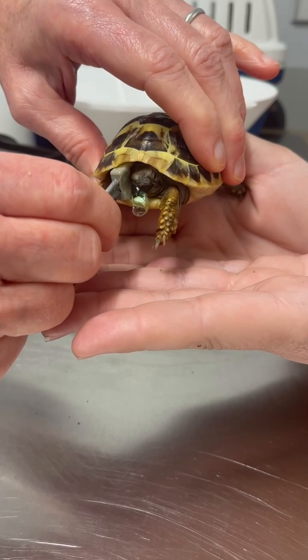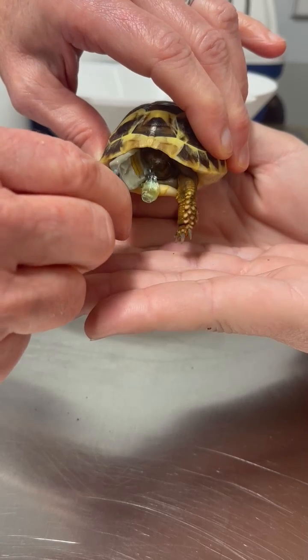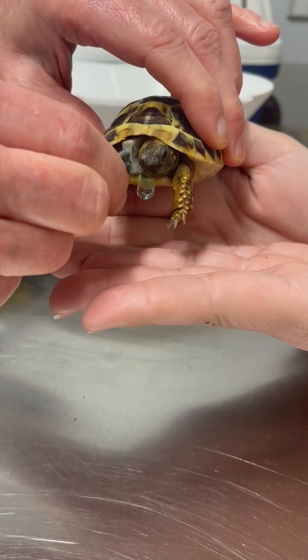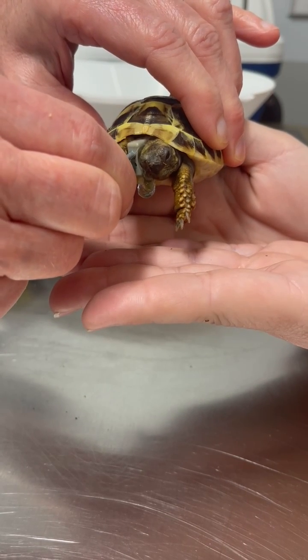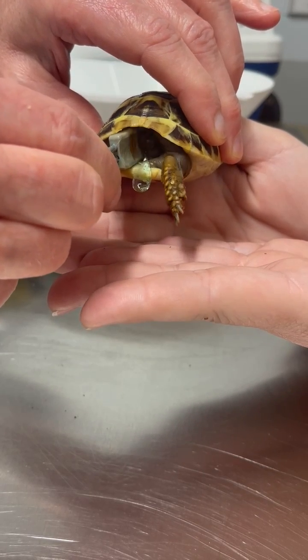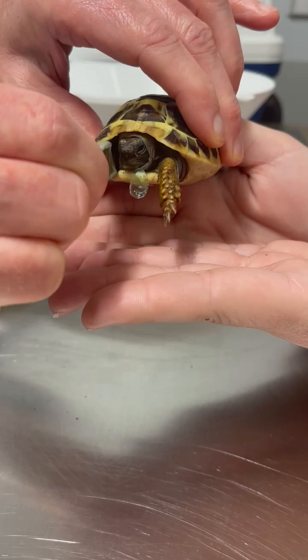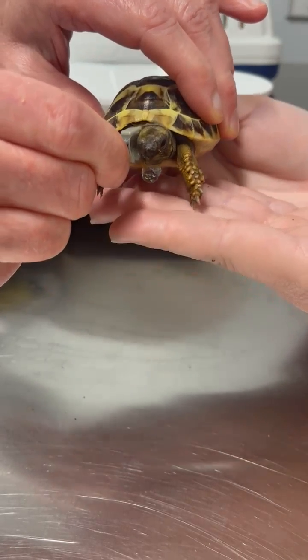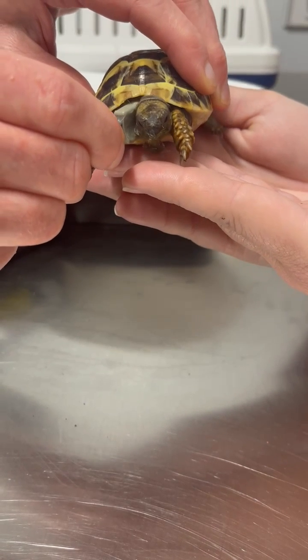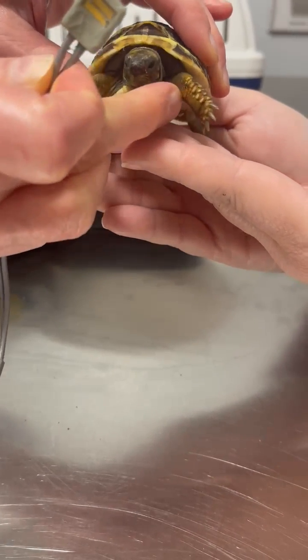He likes to move his head. You got to bring your head back out, buddy. He's like, that feels funny. Come on back out. Come on back out. It's about 70 a minute.